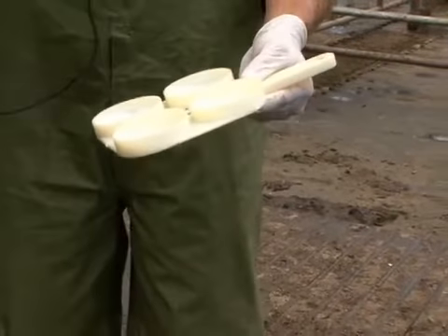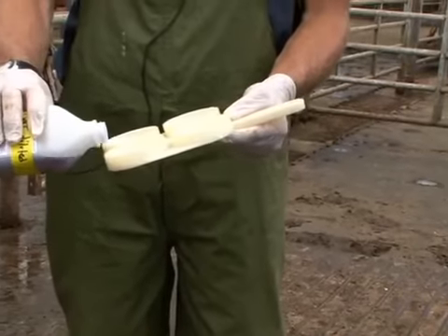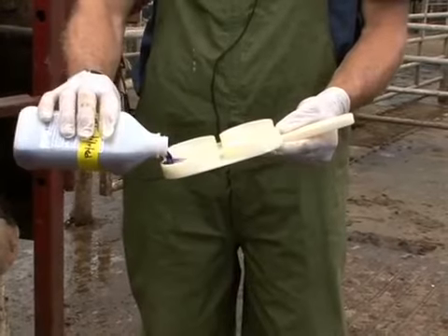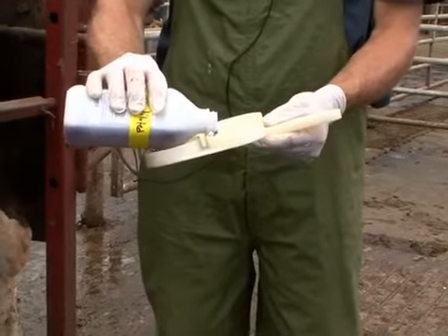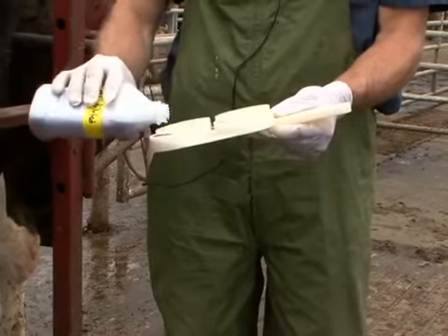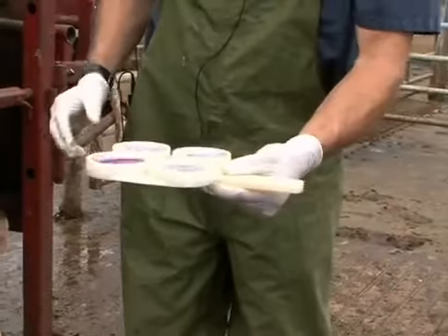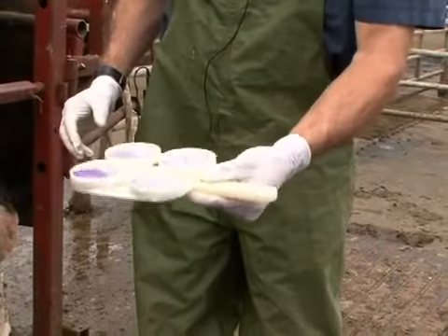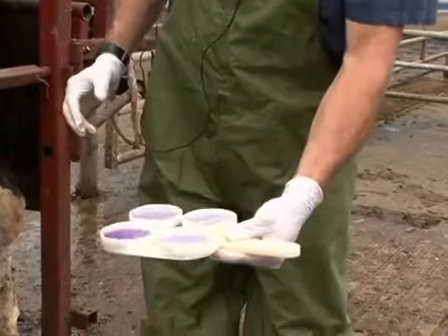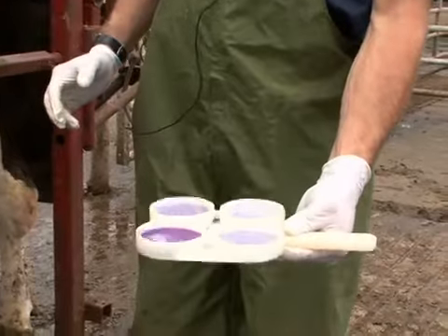And then we add an equal amount of reagent to milk per well. So this isn't an exact sort of measurement. It's cow side. We just try to guess or estimate how much milk is in each of these wells, and we add the reagent to each of these wells. Then once we have enough reagent in each, we start to just rotate it and shake it and rock it back and forth and rotate it back and forth until we get a complete mixture of the reagent with the milk.